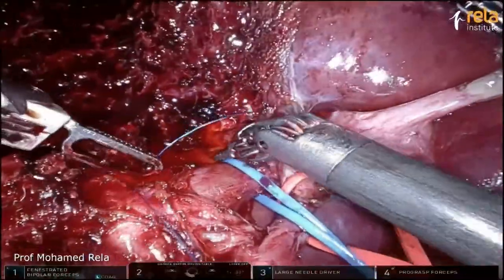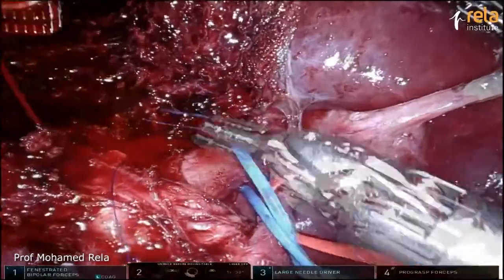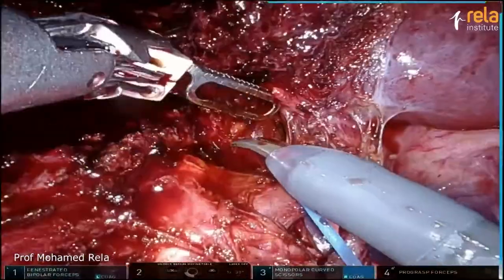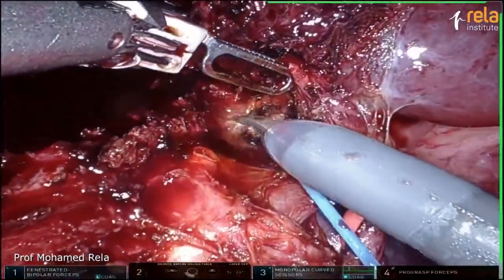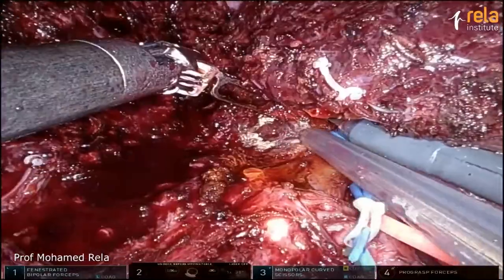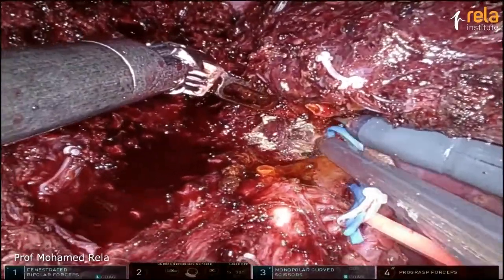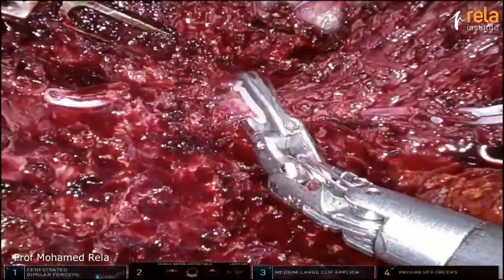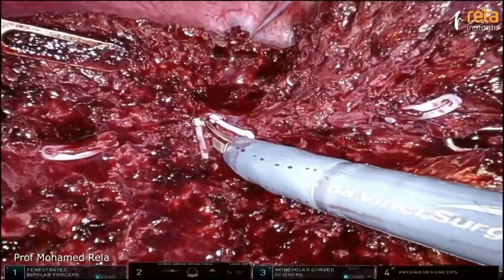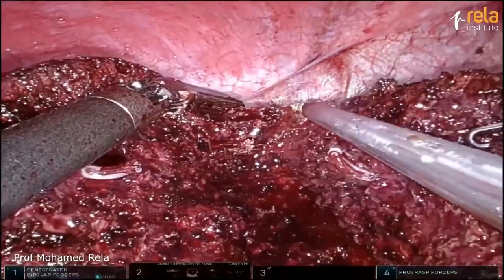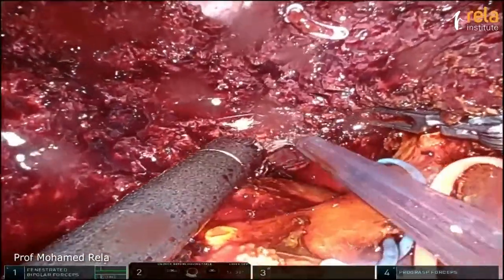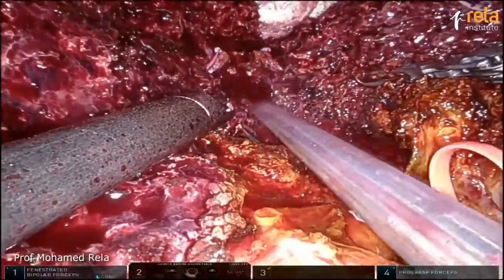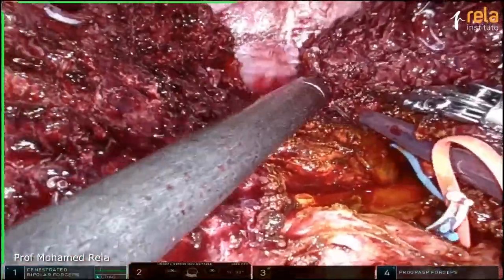You can see a small caudate branch from the left portal vein. These things can be very nicely ligated with the robot. Getting into the plane between the caudate and segment four to complete the parenchymal transection. This is the segment eight vein, which is being isolated and divided. There was another small segment eight vein above as well which was divided. The last bits of transection — the plane in front of the caudate — until you see the left and middle vein together.